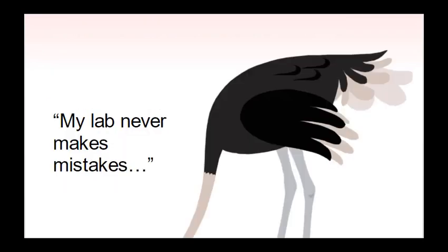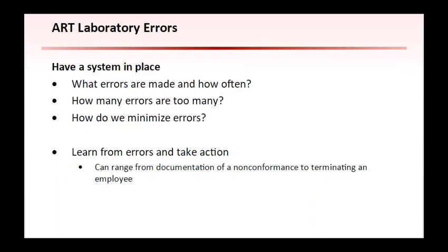The greatest error is to bury one's head in the sand and think that your laboratory never makes mistakes. To run an efficient clinic and laboratory, a system must be put in place to learn from and act on the nonconformances and errors that occur.